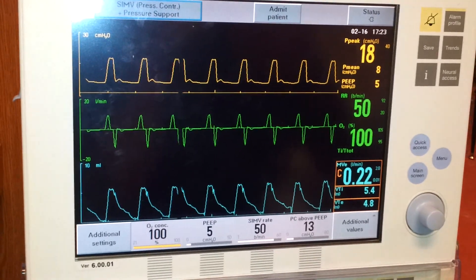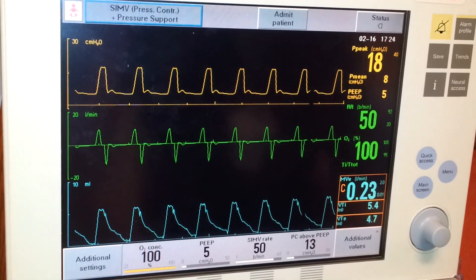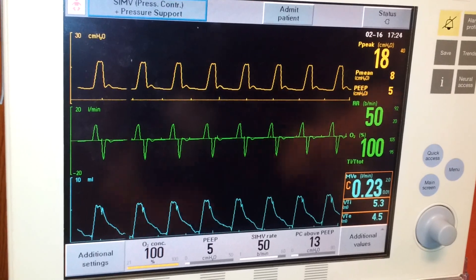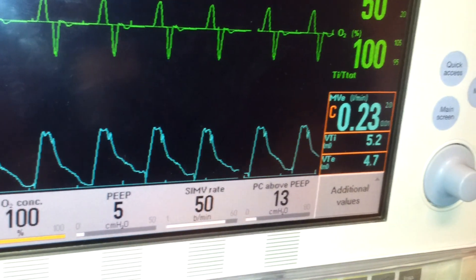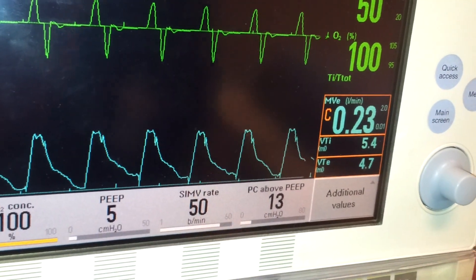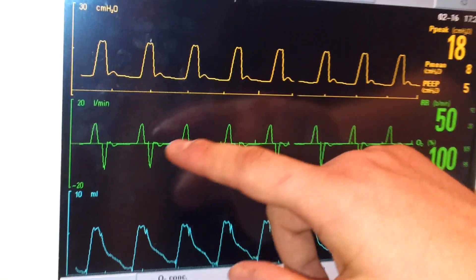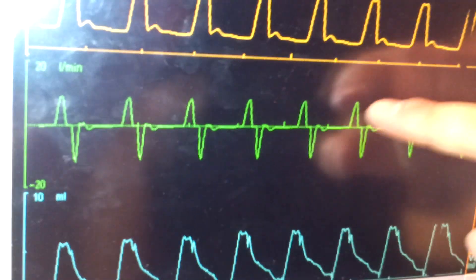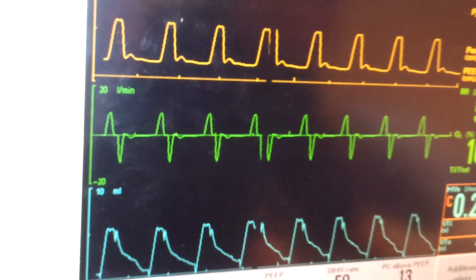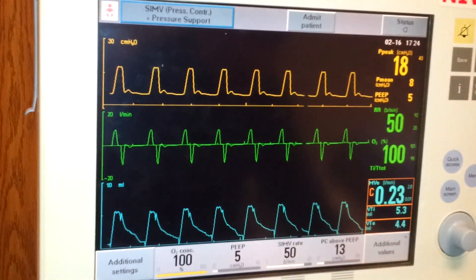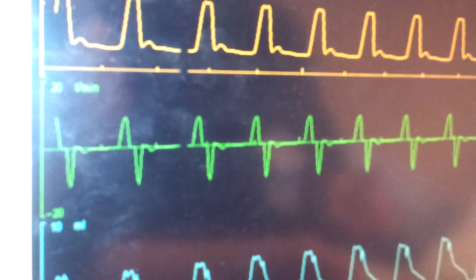Step four is assessing the graphics. You want to make sure there are minimal leaks by comparing the inspiratory and expiratory tidal volumes — both displayed here. You should expect some leaks because it's an uncuffed tube; right now they're actually pretty close to each other. You should assess the flow waveform for any signs of secretions — the flow waveform is the one in the middle. Basically, you're looking for little bumpy lines, which indicate secretions or water in the tube. You should also assess the amount of air trapping — you want the flow waveform to return to baseline; if it doesn't, you should suspect air trapping.